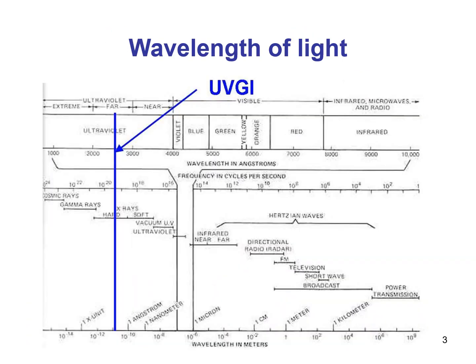The spectrum of radiation from ultraviolet on the left to infrared on the right is shown in the slide. The visible spectrum is in the middle. The blue bar indicates the specific ultraviolet germicidal wavelength. You can see that the UVGI is beyond the visible spectrum. Your eyes cannot see it.